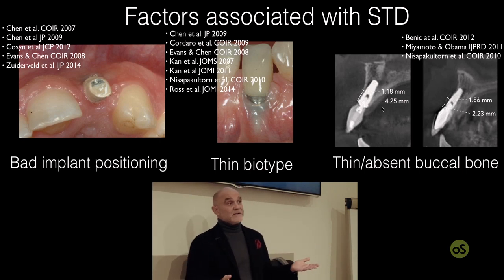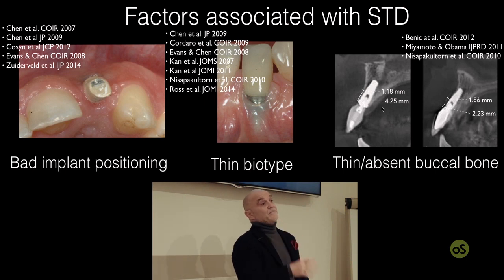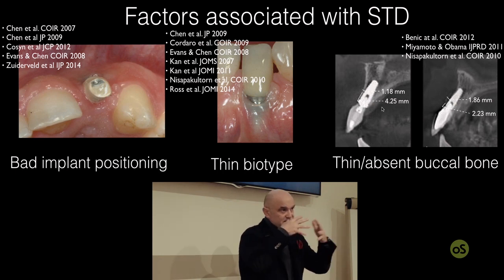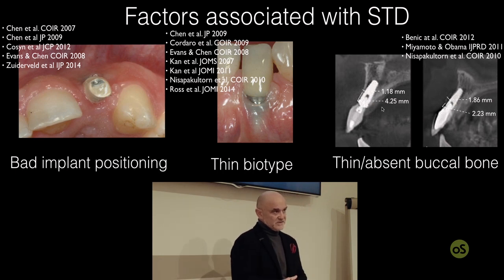Obviously, it's easier to clean the root because we can do root planing, while it's more complex to clean the implant surface because it's more rough. But today there are some good tools like the titanium microbrushes that help us a lot because of the very good visibility and the very, very good access to clean the implant surface when this is exposed due to gingival recession.